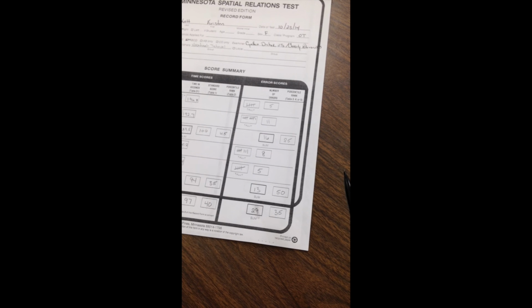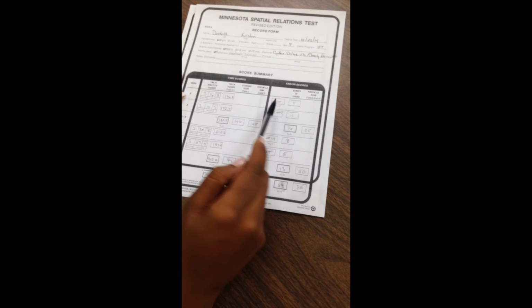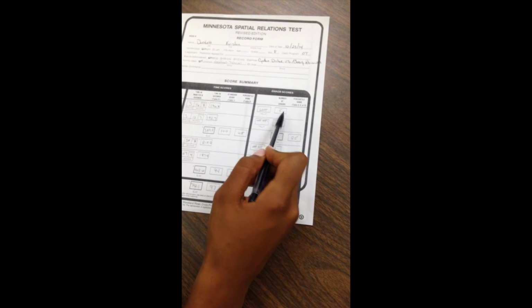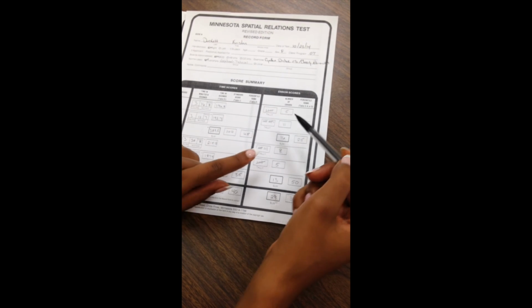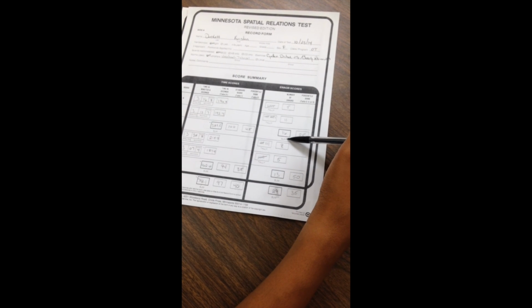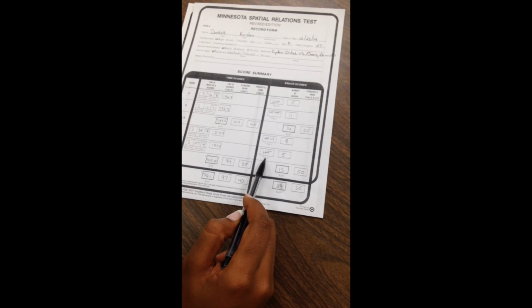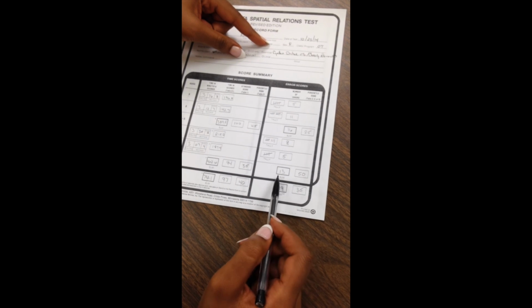Now we're going to discuss error scores. On board A, Kristen made a total of 5 errors. You make your tally marks in the appropriate box, and then write the number in numeric fashion in the appropriate box. You follow suit with board B. You have your tallies, your official number, and then you add the error scores for boards A and B together. Follow suit with boards C and D. On board C, Kristen had a total of 8 errors, your tally and your number. On board D, she had a total of 5, tally, number. And then you add those up for boards C and D, and you have your sum.